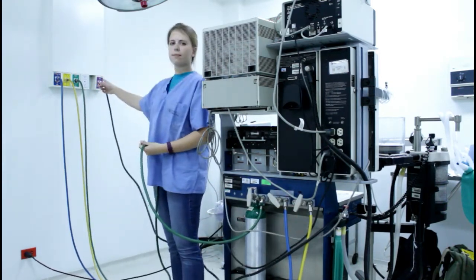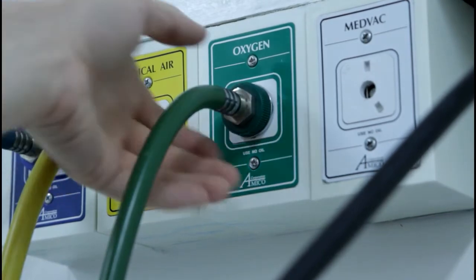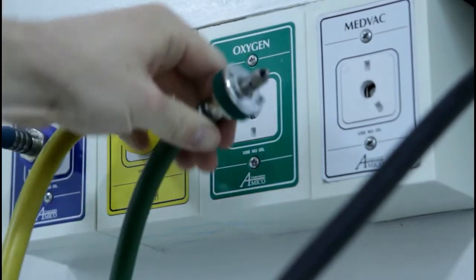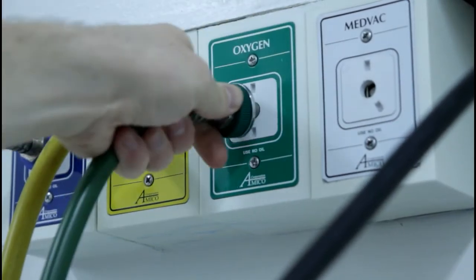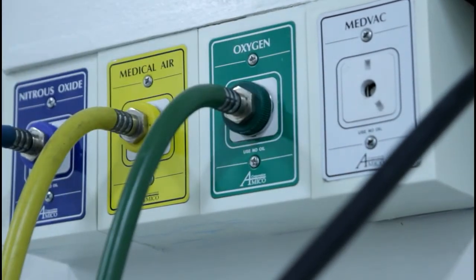In addition to the color coding system, the tube connections to the wall are keyed specifically for each gas. The connection for each gas has a slightly different shape to ensure that each is connected to its matching gas.